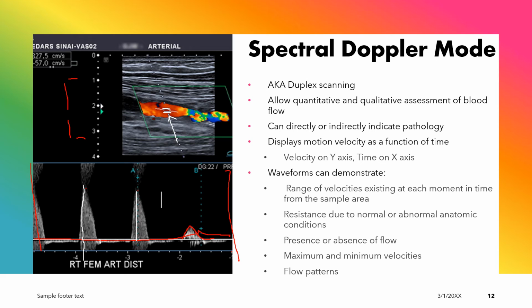Now, we know that the resistance that we can see can also affect the shape of the spectral waveform. Without knowing exactly how much background you've probably had in this, I hope I won't be boring you, but I'll briefly go over what some of our resistances appear like.